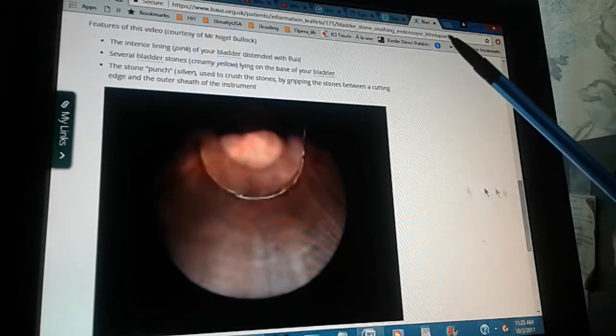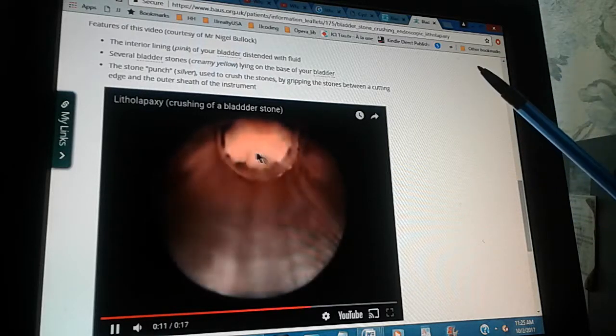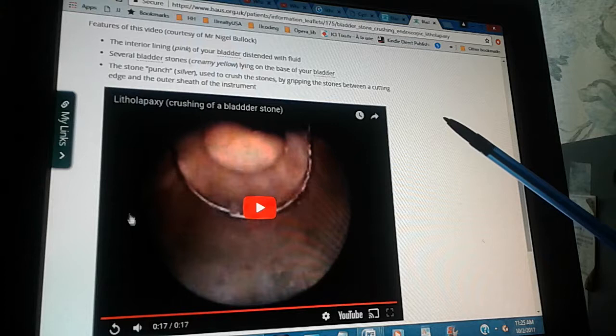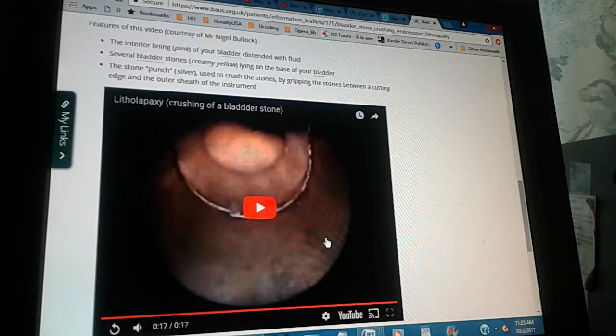The interior lining, or pink, of your bladder is distended with fluid. Several bladder stones, creamy yellow, lying on the base of your bladder. The stone punch silver is used to crush the stones by gripping the stones between a cutting edge and the outer sheath of the instrument. That is what a litholapaxy is — the crushing and washing out of stones.